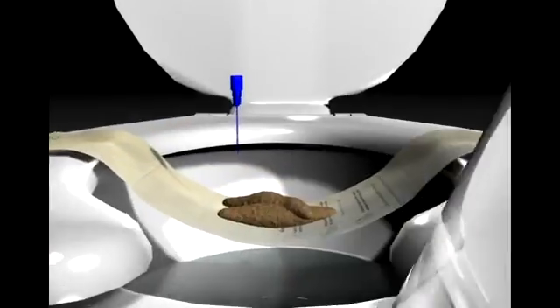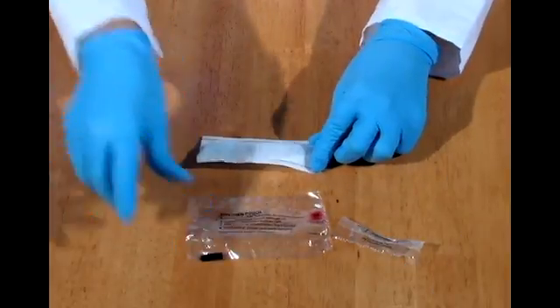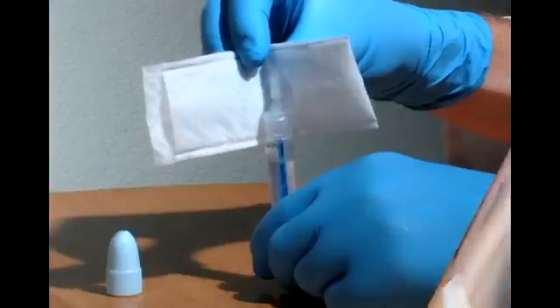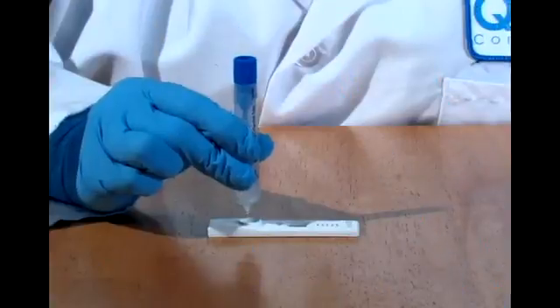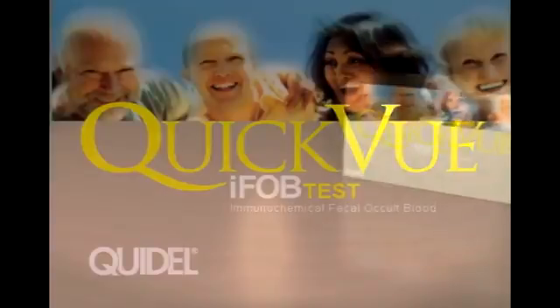This short video will demonstrate how easy the QuickVue iFob test is for your patients to use and for you to run and read the results. In order to use the test, you will need to have the following components, all of which are provided in the kit.